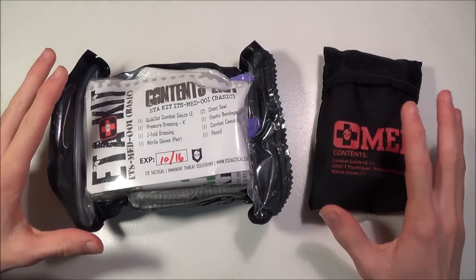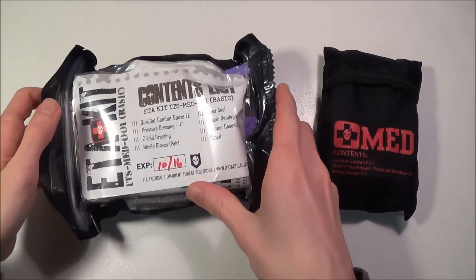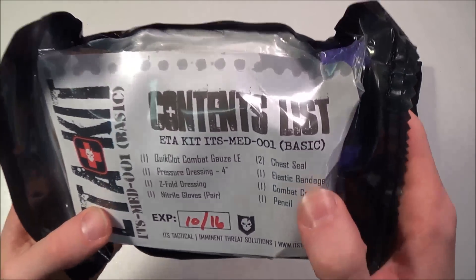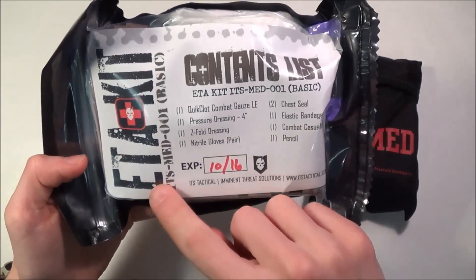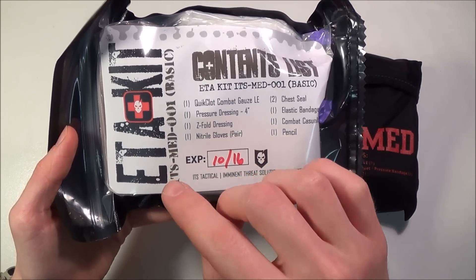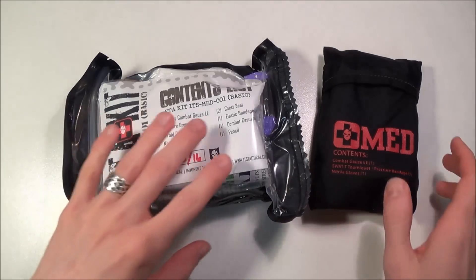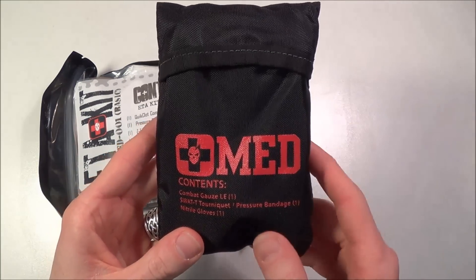I wanted to talk about a couple of trauma kits I got in the mail from ITS Tactical and do a little bit of ranting. First of all, I have the ITS Tactical ETA trauma kit — this is the basic kit. ETA stands for exterior bleeding, tension pneumothorax, and airway obstruction, or maybe extremity hemorrhage. And the EDC trauma kit obviously stands for everyday carry.